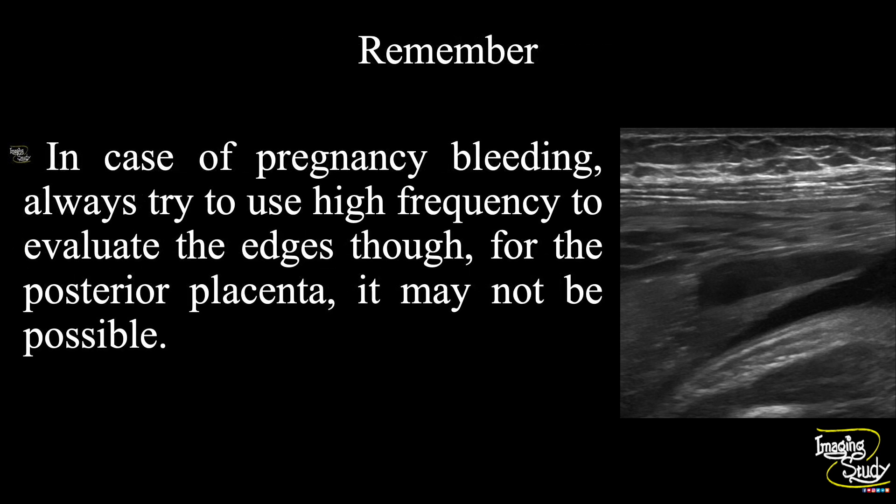The take-home message: in cases of pregnancy bleeding, always try to use a high-frequency transducer to evaluate the edges clearly. For a posterior placenta, it may not be possible — in that case, you may magnify the image and try to evaluate the edge of the placenta to exclude hematoma.